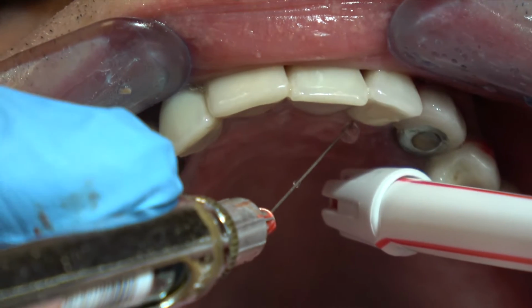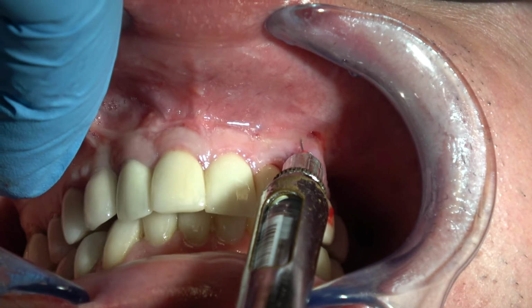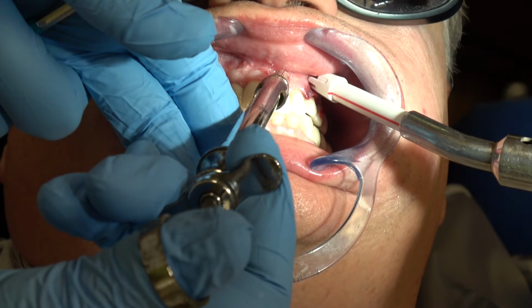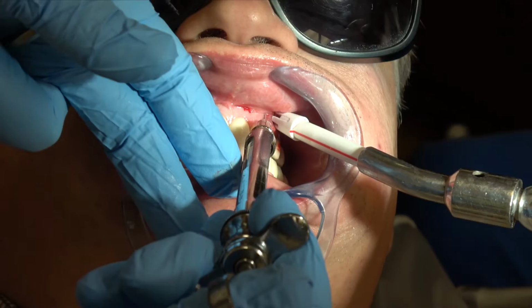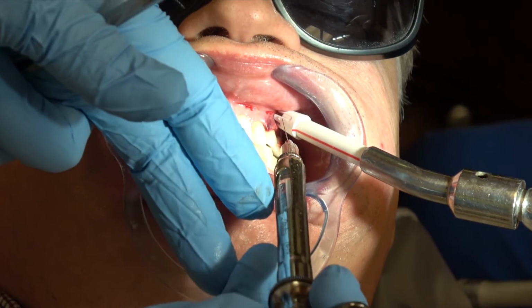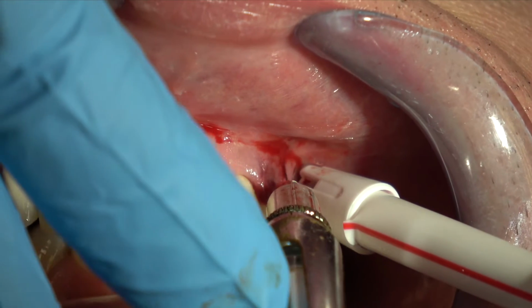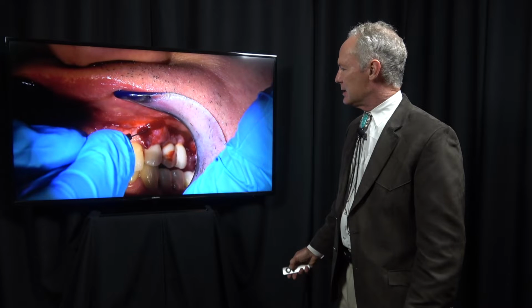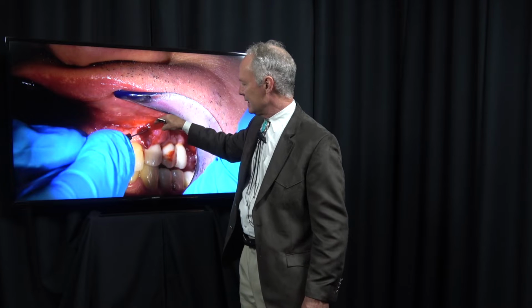It's very important in these situations that you numb the palate or the lingual as well as the facial. And this is an intraligamental intrasulcular injection, starting out with Citanest plain and then either lidocaine or Marcaine with vasoconstrictor. So here we're measuring. The incision is not in the sulcus, but it is in attached or keratinized gingiva.